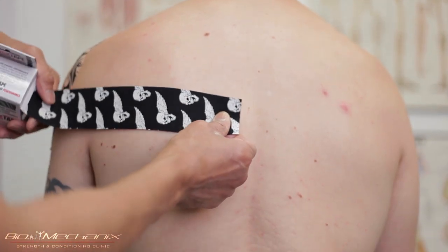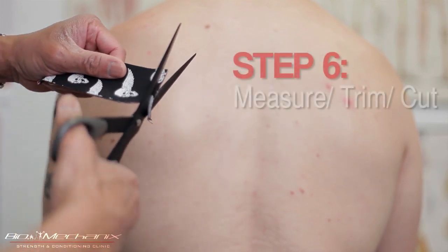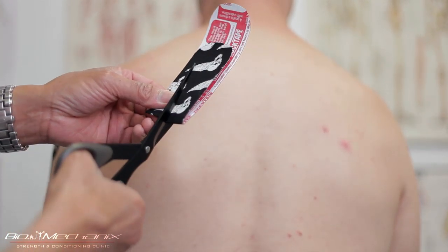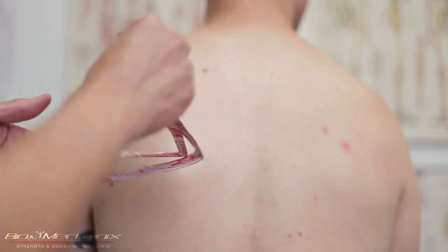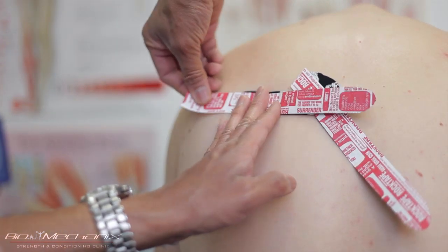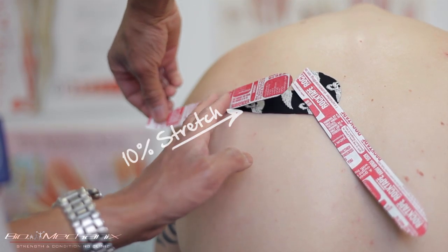For the rotator cuff taping I'm going to use the same method as before on his deltoid — fork the tape, anchor it just next to the spine, not immediately on it, and bring it up towards his shoulder where his discomfort is on his rotator cuff muscles.